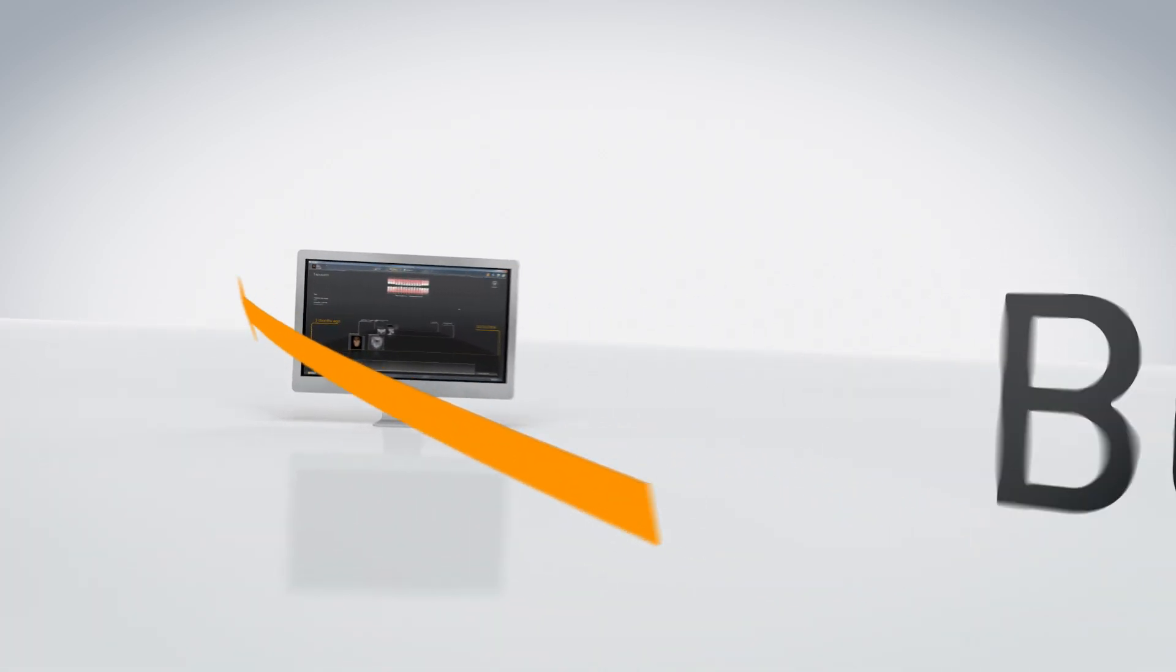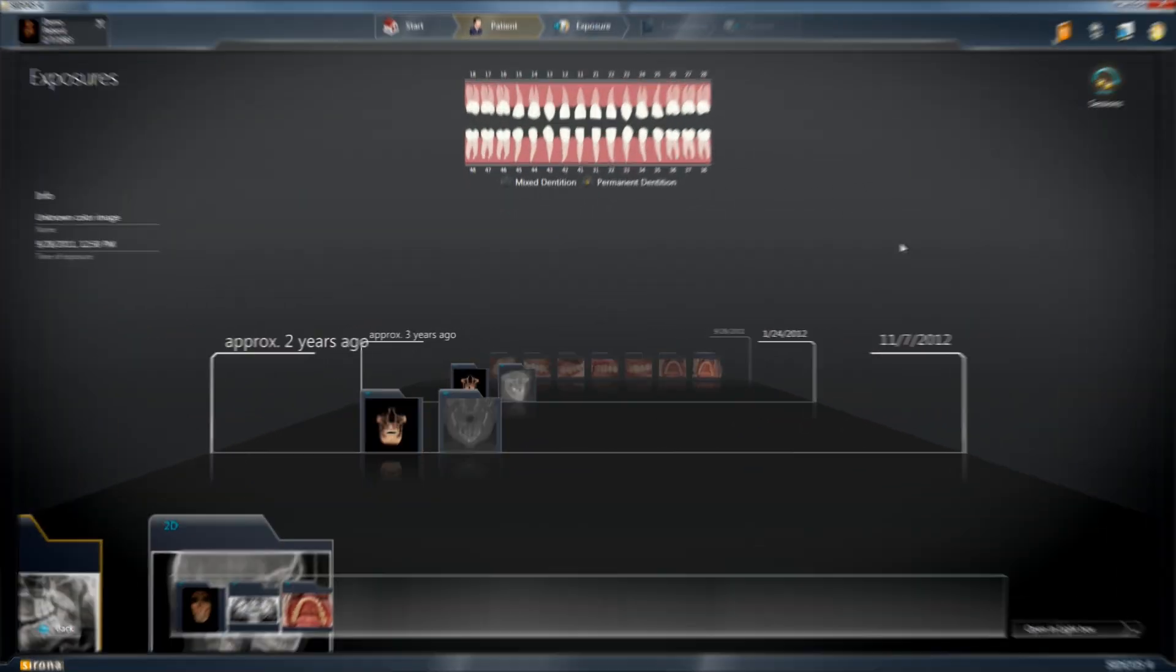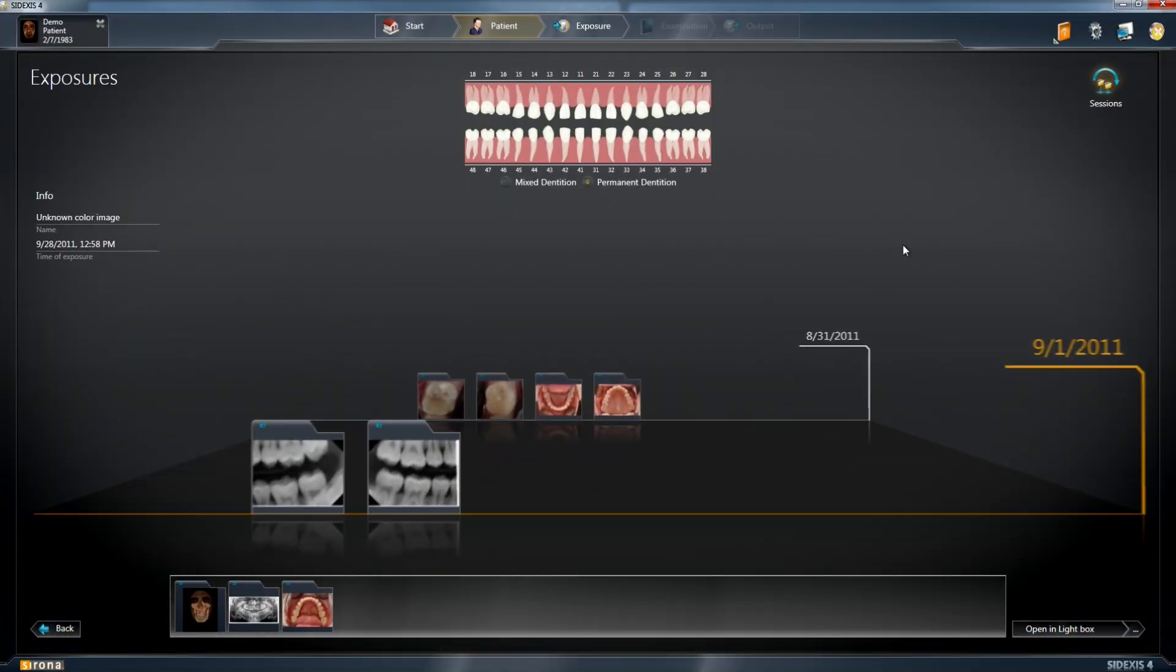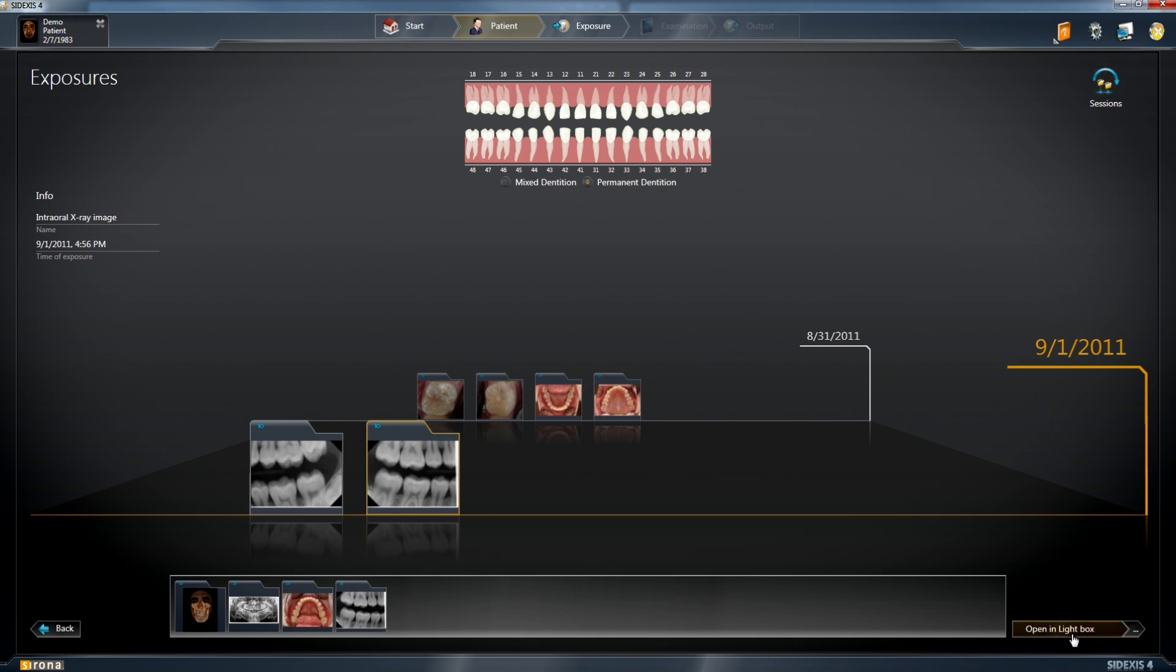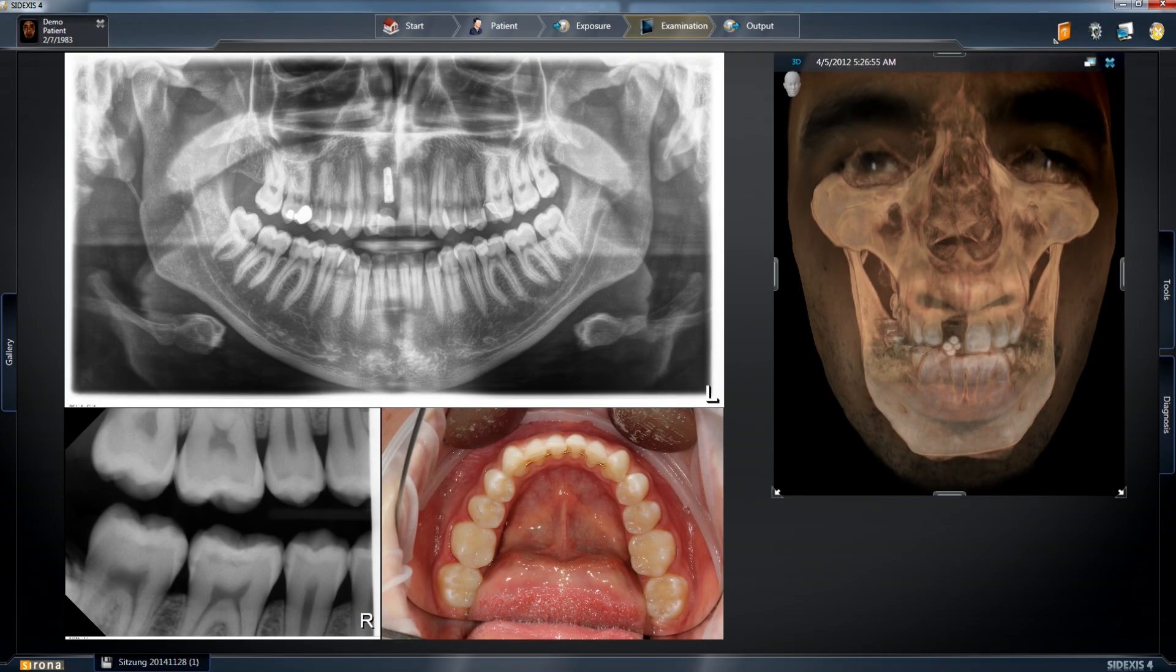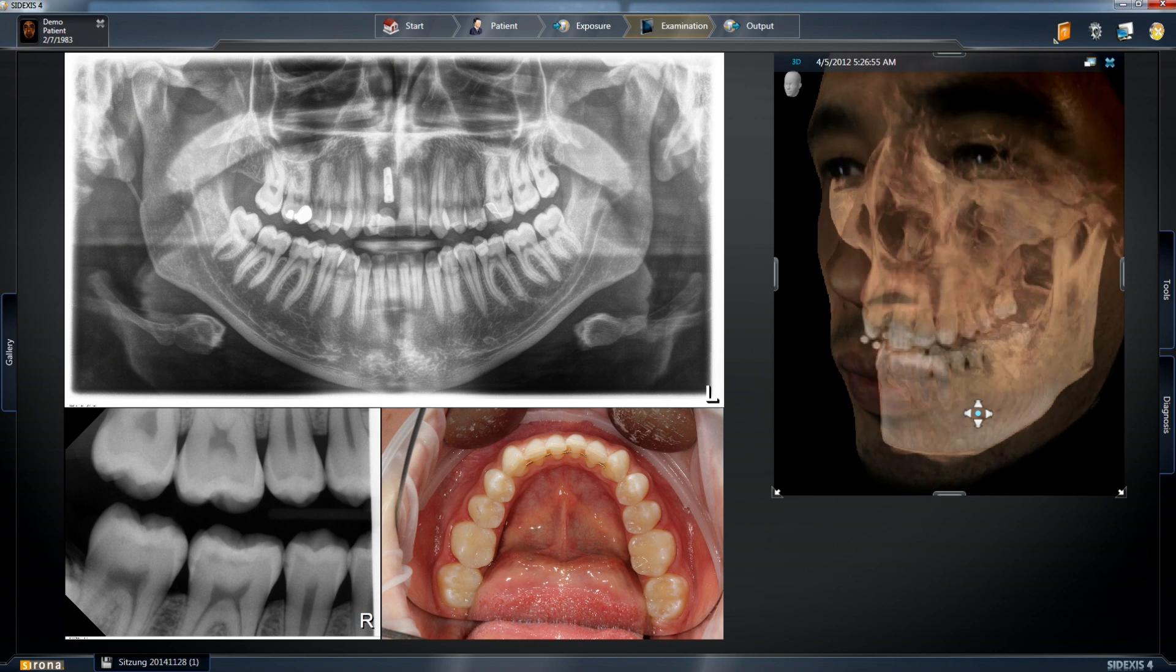With a new timeline feature, your patient's visual history is always accessible. And with just a few clicks, you can compare all of your images in the lightbox: 2D, 3D, intraoral or camera.